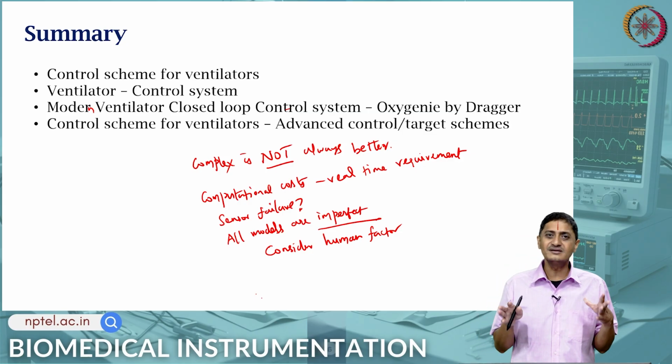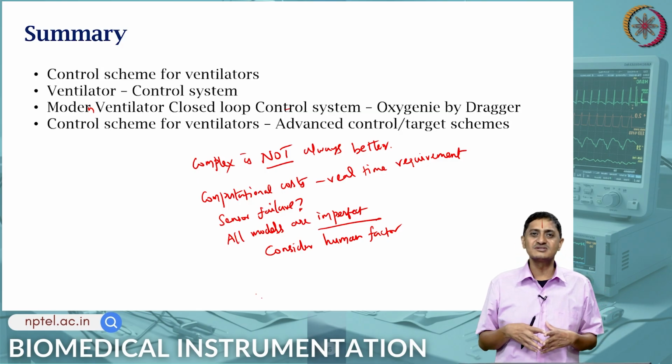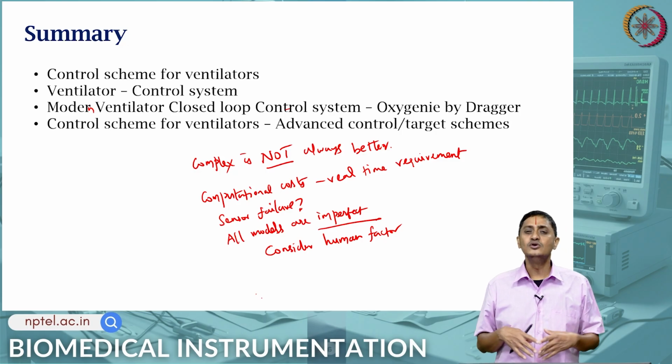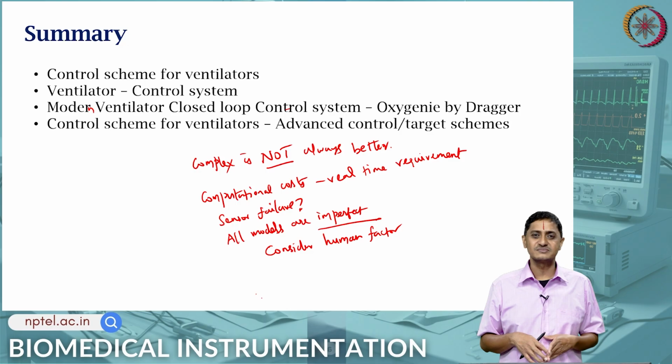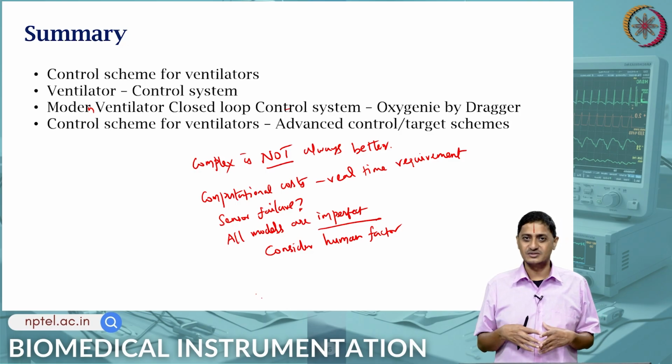Yes, you are looking at an advanced control. These control systems are relatively well developed. For example, these automotive control systems are relatively well developed. You want something like that for your ventilators. You want that type of control, that type of smoothness in your control for your ventilators.